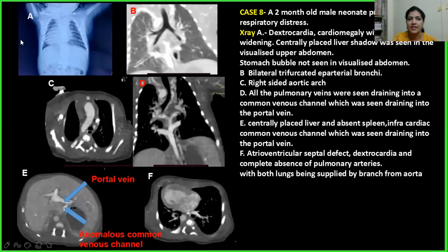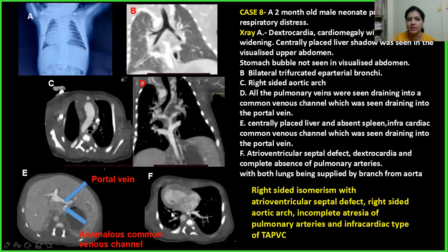Case 8: A two-month-old male child. On X-ray, dextrocardia, midline liver, bilateral trilobed eparterial bronchi, and right-sided aortic arch were seen. Pulmonary veins formed a venous channel draining into the portal vein. Dextrocardia, AV septal defect, and complete absence of pulmonary arteries were noted. This was a case of right-sided isomerism with AV septal defect.